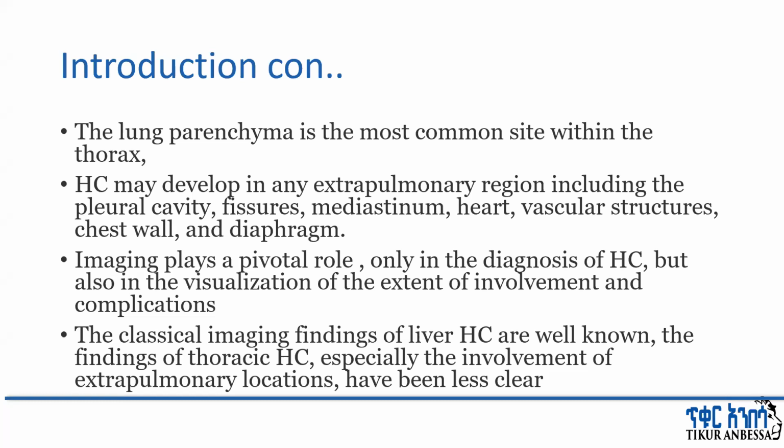The classic imaging finding of liver hydatid is well known. Findings of thoracic hydatid in extrapulmonary locations, however, have been less clear and confusing, and usually it is a diagnostic challenge.